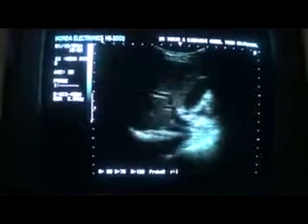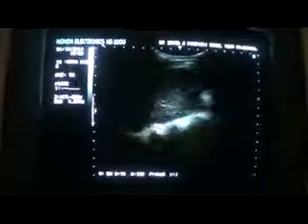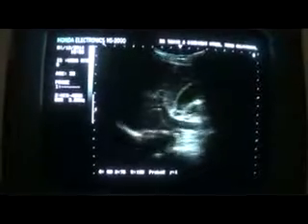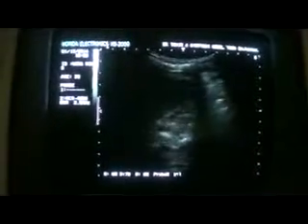Thank you very much. Now remember that whenever there is one anatomical anomaly seen, then look for so many others. As for example, in the same patient, this is the gallbladder, portal vein, liver, and I am trying to see the right kidney, and there is no right kidney seen in the right lumbar location.